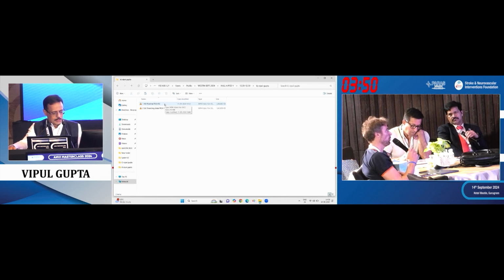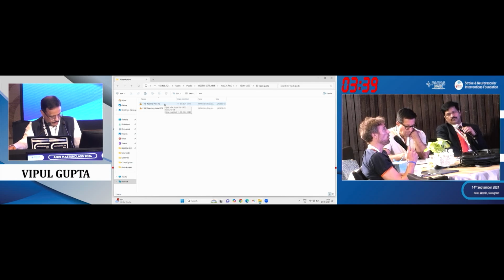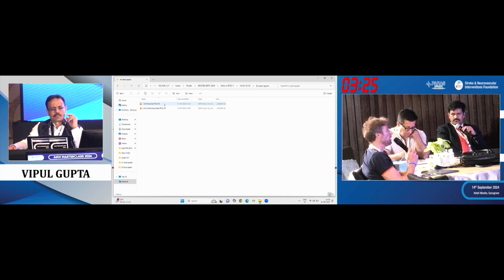We don't have data for one or two flow diverters because we don't have the answer. I put only one, and I have to say we're happy about that. In the literature, for flow diverters in the hemorrhagic situation, the rebleeding rate in the first 2 weeks is 4%. So there is rebleeding after flow diverter in the hemorrhagic and acute phase, but I think it does not justify 2 layers systematically, because you also increase the thrombogenicity of the procedure. So that's also something we should consider as well.